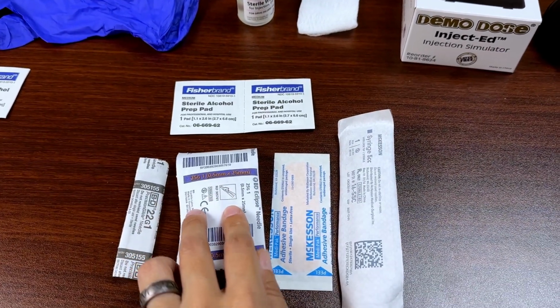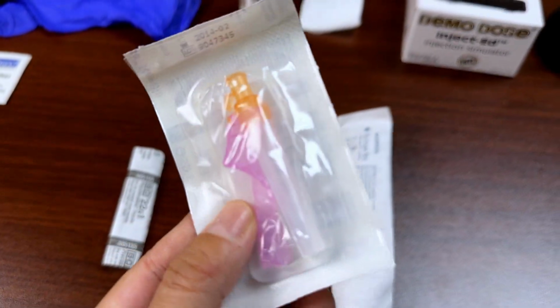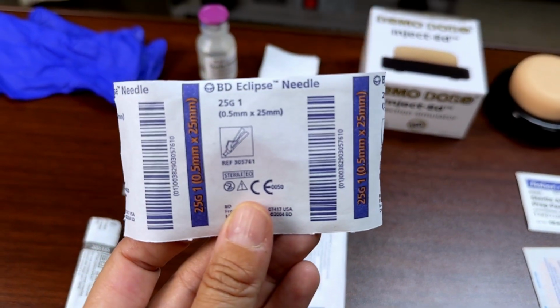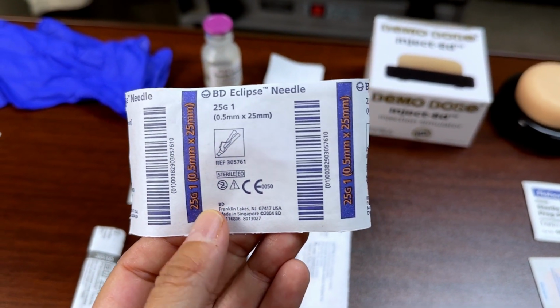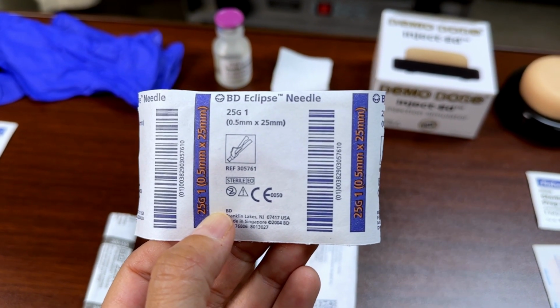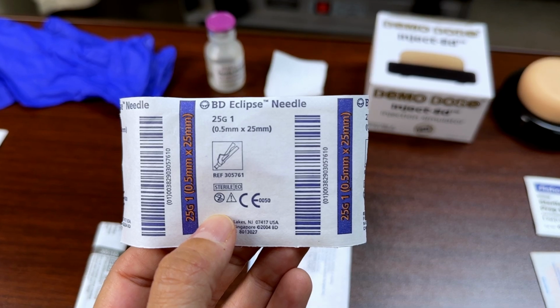We also need the injecting needle, which in this case I'm going to use a 25. And you'll see on the needles, it'll tell you how big of a gauge the needle is. The bigger the gauge of the needle, the smaller the lumen. And it'll tell you how big the needle is. So this is a 1-inch needle.